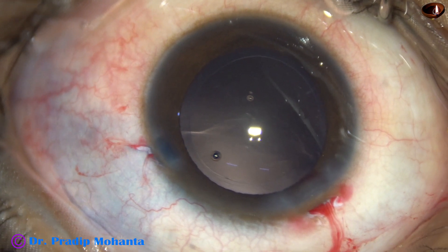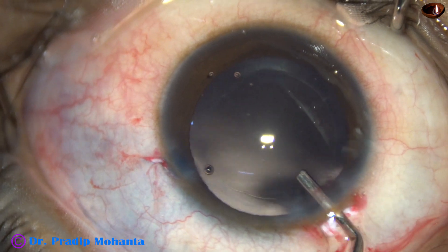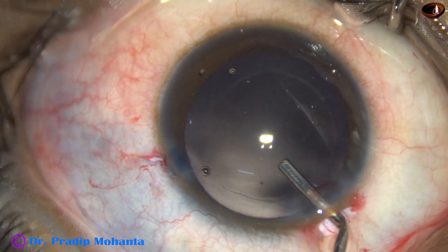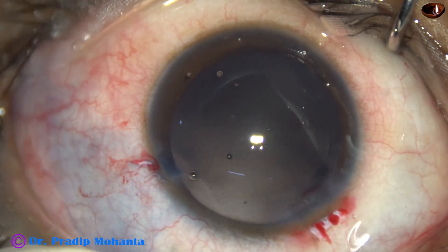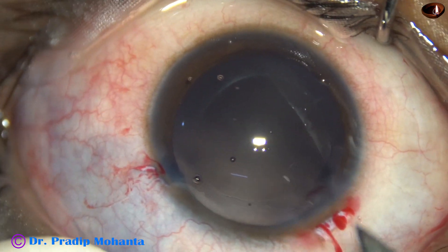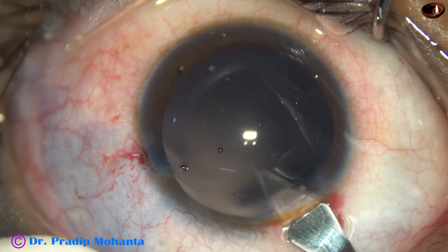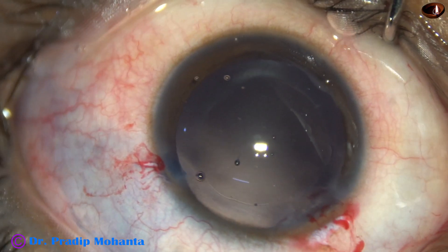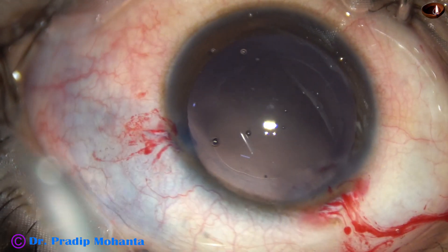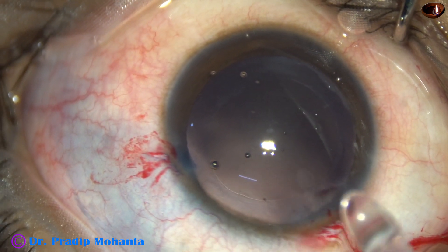The main wound is 2.8 mm at this time, and I am going to enlarge it to about 3 to 3.1 millimetres before implanting the multipiece intraocular lens. The main wound is enlarged by the keratome — we must cut when going forward, engage at one side of the wound, and by forward movement the wound is cut.